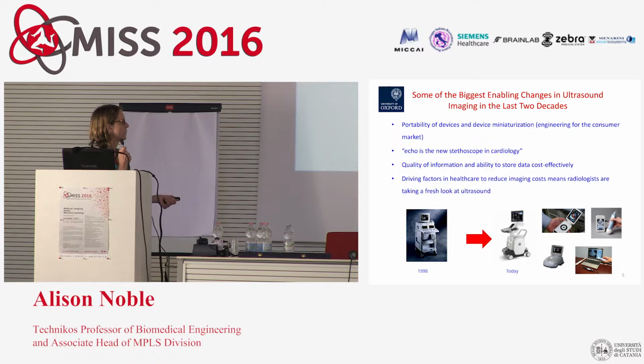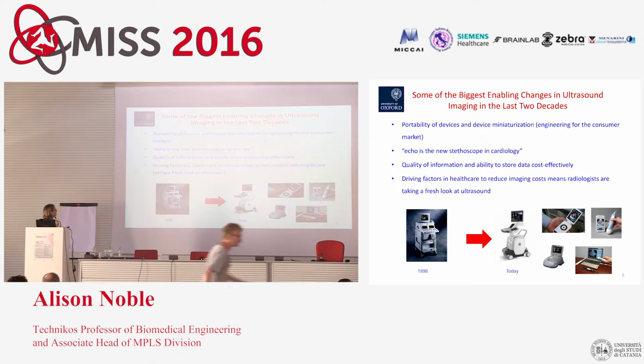You get laptop-style ultrasound, you get USB plug-ins as shown here, and you get very tiny ultrasound devices dedicated for A&E type applications. So people are taught now, and it's been around for a number of years, that echo is the new stethoscope in cardiology.